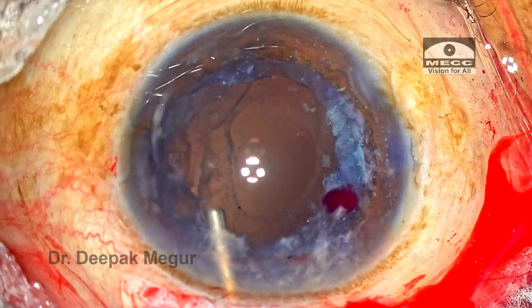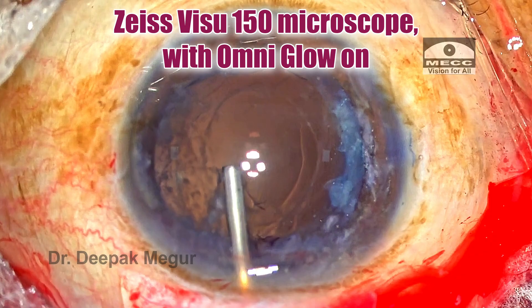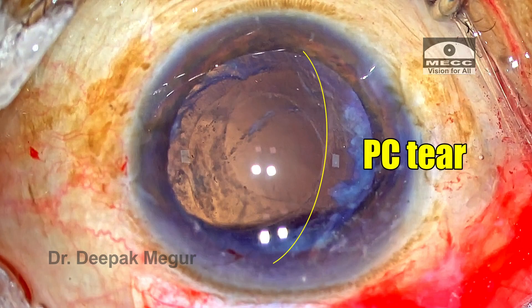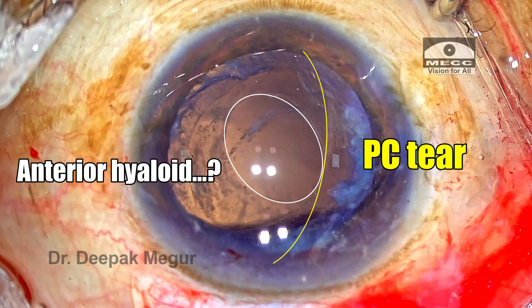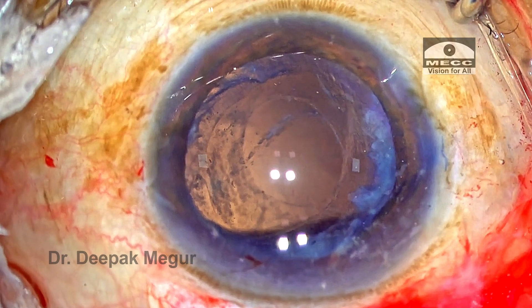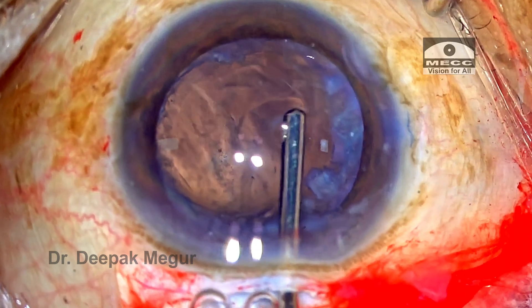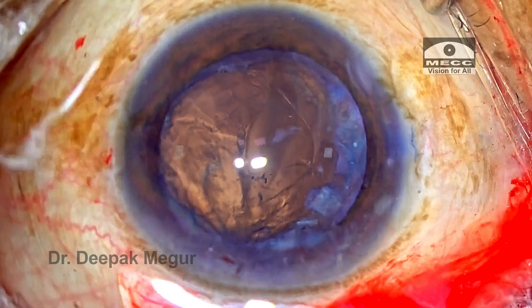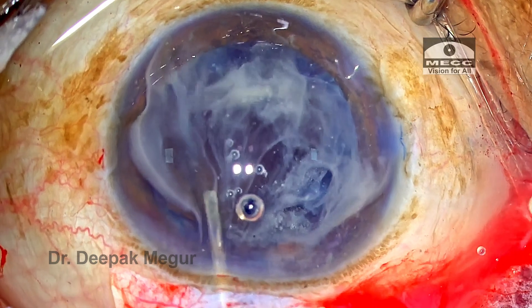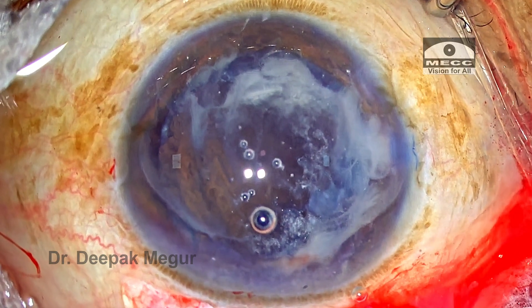The visualization is not so clear as the coaxial illumination is not yet turned on. The microscope being used is an old Zeiss Visu 150 with omni-glow on. With retro-illumination on, we can see a couple of demarcation lines suggestive of a possible posterior capsule tear. For a moment she's not sure — she gently irrigates to confirm, and becomes convinced that there is a vitreous prolapse. She stops irrigation, goes back, and injects triamcinolone acetonide — though it does not stain the vitreous as well in the presence of OVD, adding another challenge. She is now convinced of the presence of vitreous and it's time to perform vitrectomy.